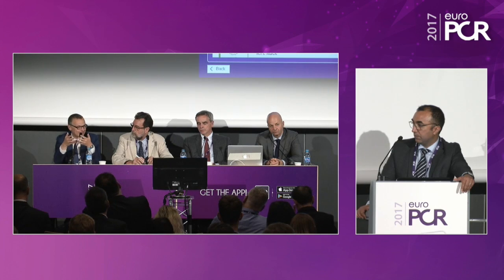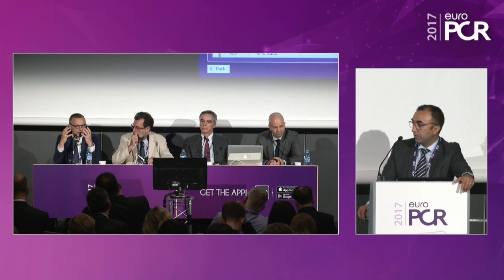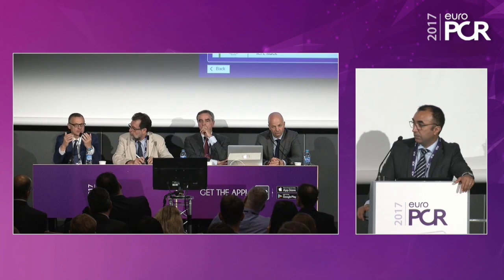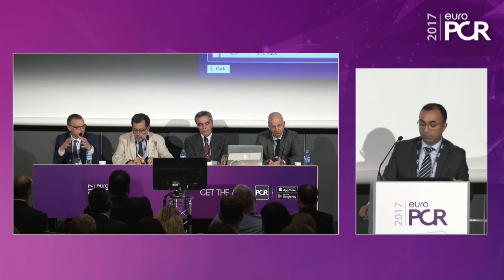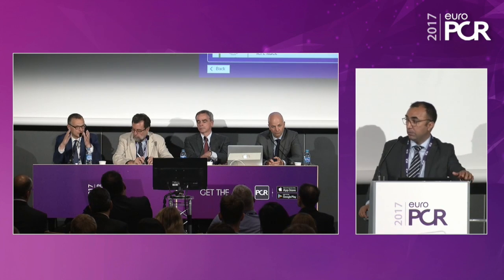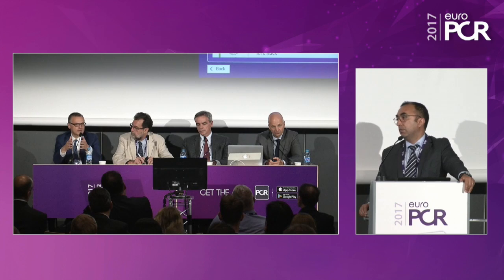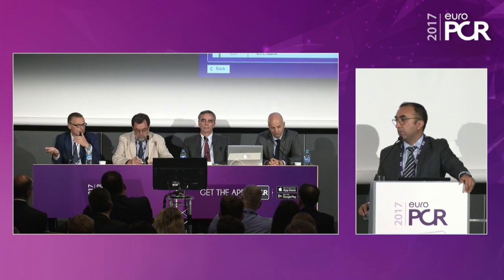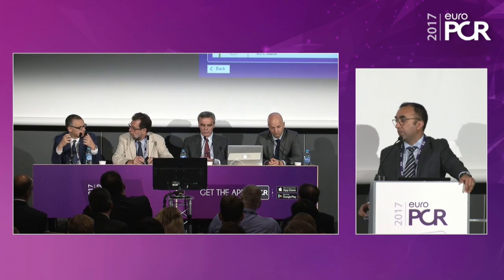In surgery, we built this experience in functional MR that adding leaflet repair and annuloplasty is a really strong solution for functional MR. The freedom from recurrence of MR is amazing. So combining the two procedures, why does it work? Because you basically act on the two components. The component of annular dilatation is treated by the annuloplasty. The component of tethering is treated by the leaflet apposition. In this area where the leaflets don't touch each other, you force the coaptation. And this is enough when in combination with ring annuloplasty to improve results.